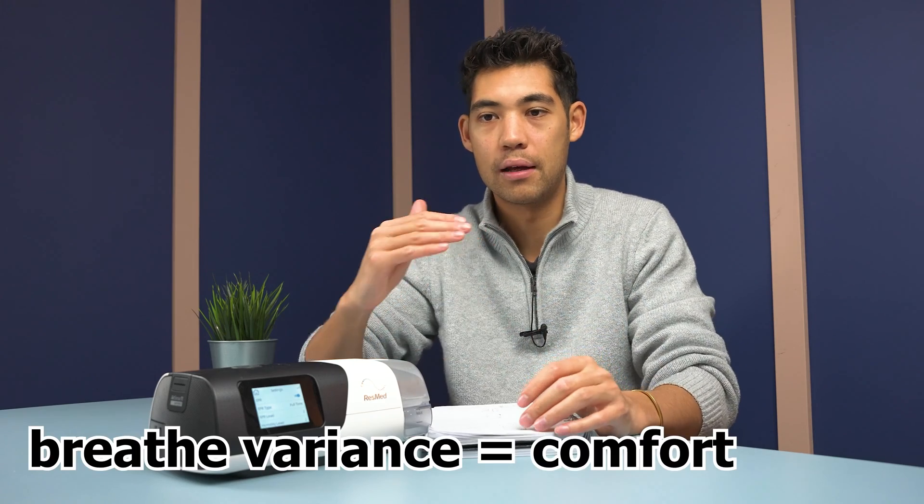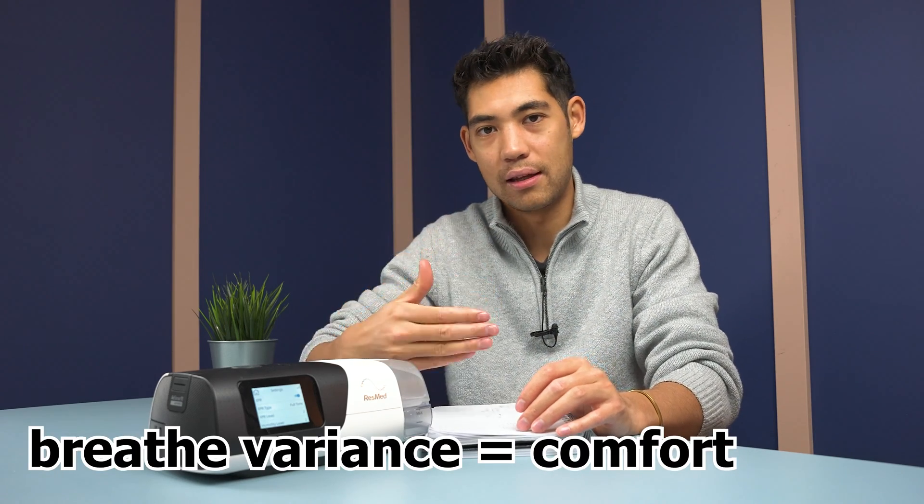The whole point of EPR is to make breathing a little more comfortable and to reduce pressure. However, one of the things that helps with comfort is actually the variance — your body having a difference between inhaling and exhaling — and that's exactly what EPR is going to do.